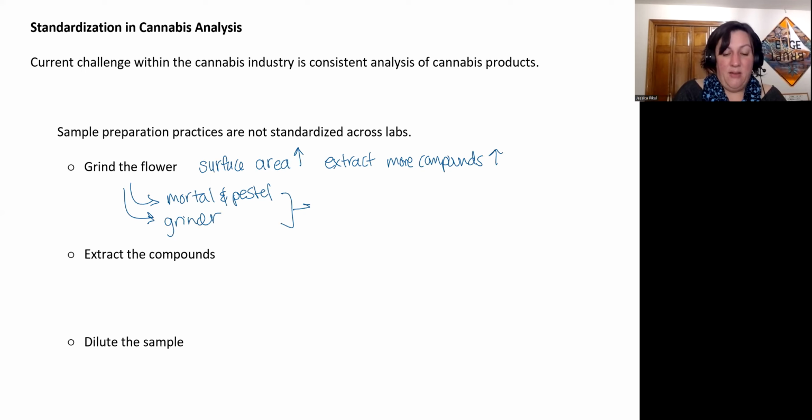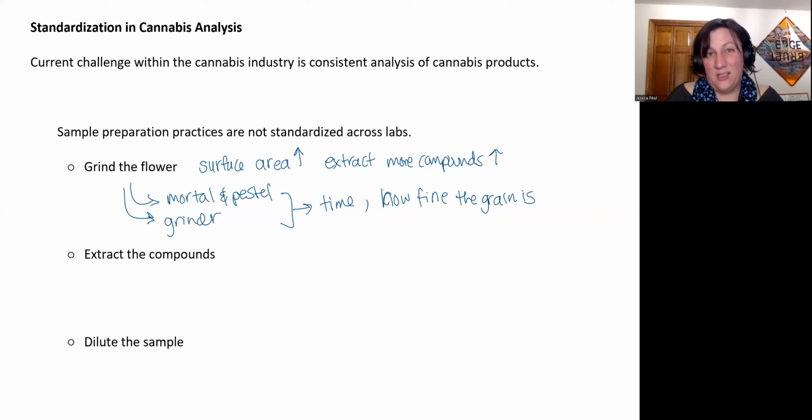And the amount of time that this step takes and also how fine the grain is can have a huge impact on the test results. And there isn't a standard practice here. It isn't use this type of grinder for this amount of time or use a mortar and pestle for this amount of time. And so different labs can have different levels of fineness to the grains of the flower that have been produced, which will affect your end results.